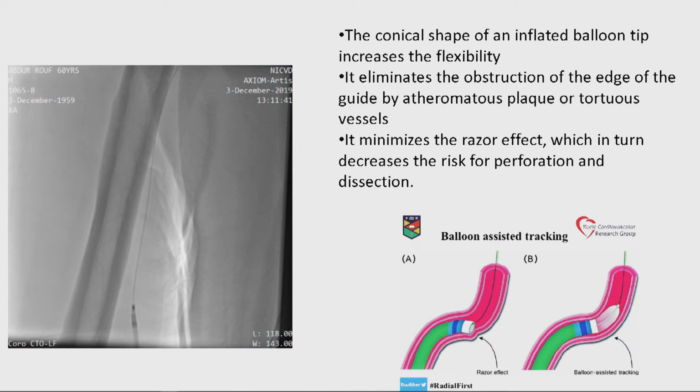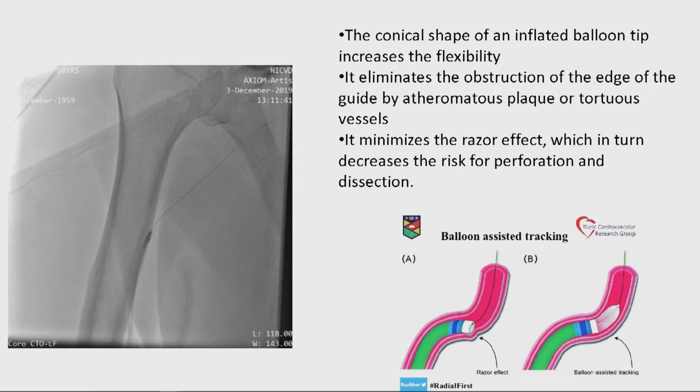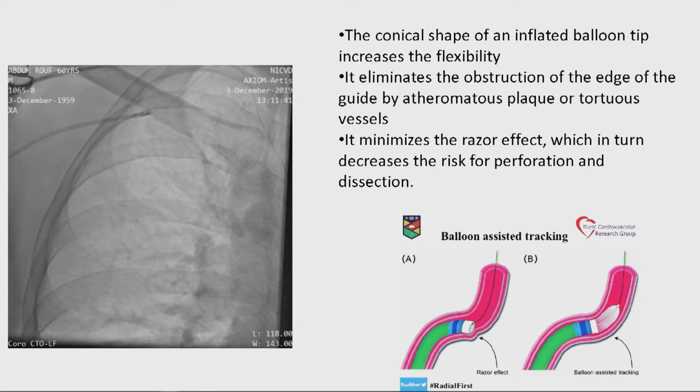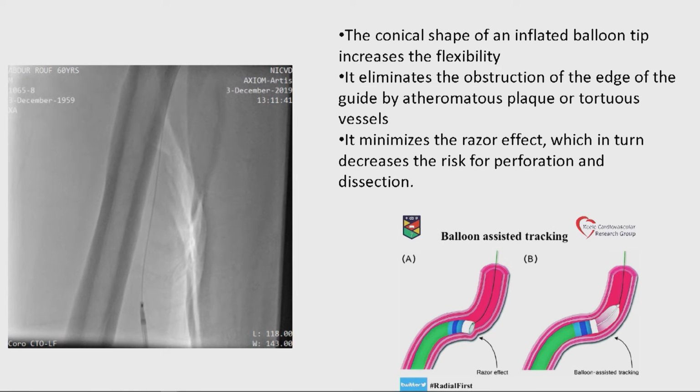You look, if we inflate the balloon just in front of the catheter, the razor effect of the catheter edge will be minimized, and with the conical shape of the balloon, it will overcome the spasm or tortuosity.